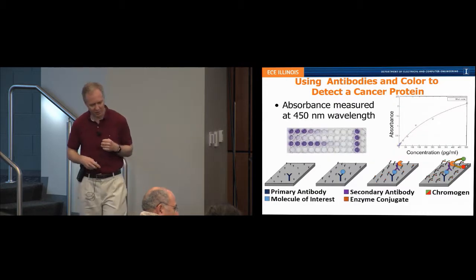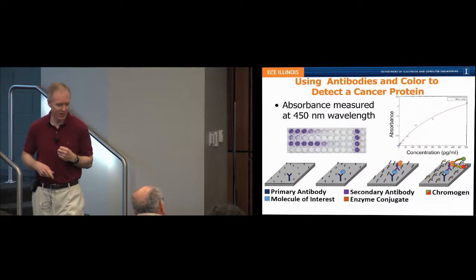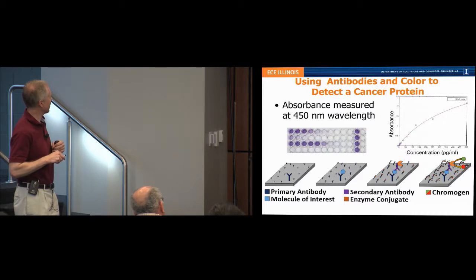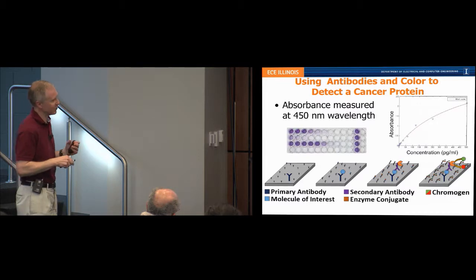So if you had a blood test taken at the hospital, the test that was performed on it was probably something like this, where they have these little plastic cartridges that have a transparent liquid in them. The cartridges all have antibodies stuck to them on the bottom. The antibodies are exposed to your blood sample. The thing they're testing for will get grabbed by the antibodies. Then they'll have a second antibody making this sandwich that has something special attached to it that will generate a purple-colored liquid.